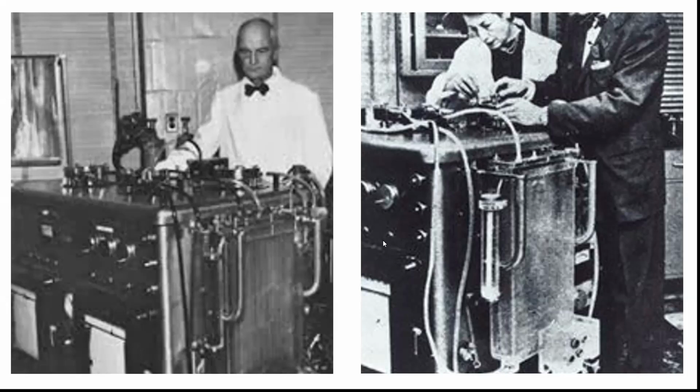Who said it? 1,000 kilograms. So this thing weighed 1,000 kilograms. It was about the size of a piano. Compare and contrast that to what we use now when we look at our cardiohelp and those types of circuits.